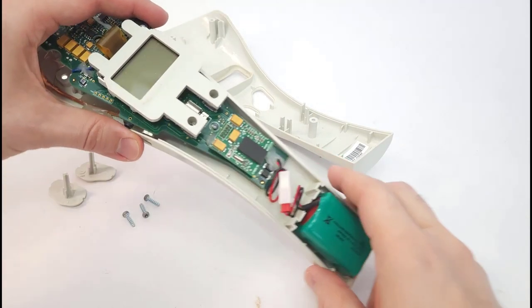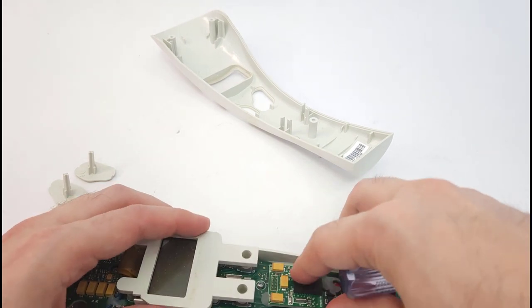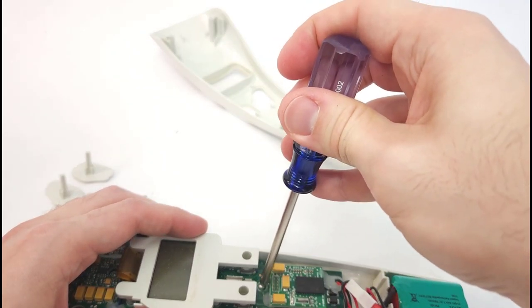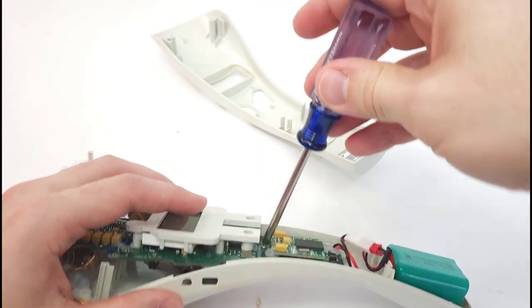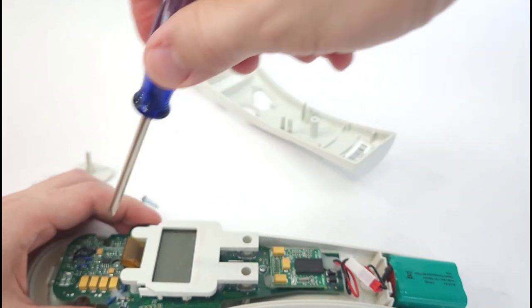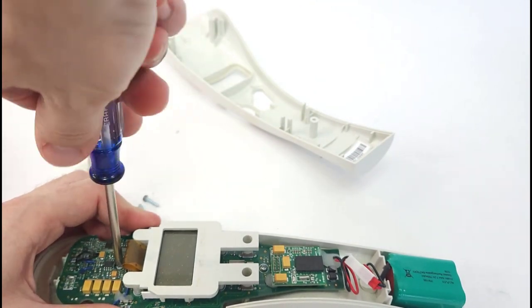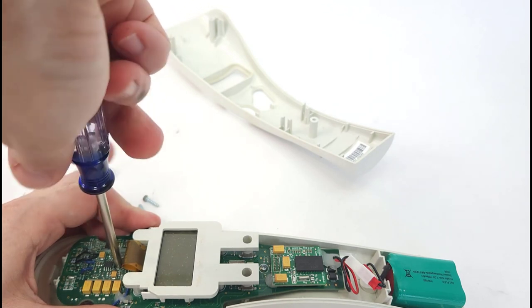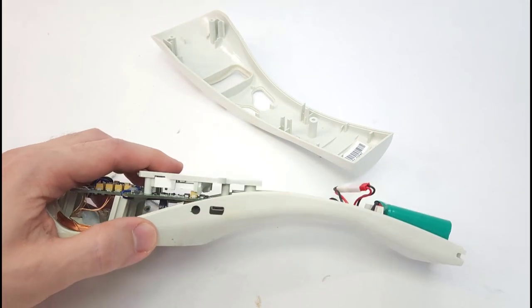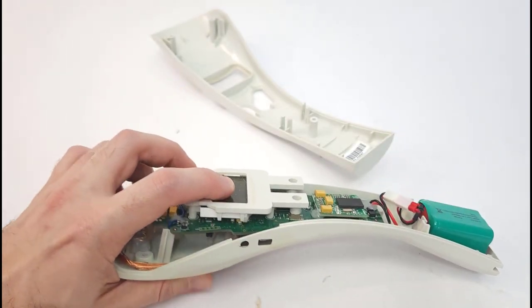Now to put everything back together, first you're going to screw the circuit board back on. Again, you want to be careful to make sure that the charging and USB ports line up with the holes in the case and you don't accidentally miss with these screws, because they can start to strip the plastic after you have assembled and disassembled this thing a couple times. You see how right there the ports aren't actually aligned.